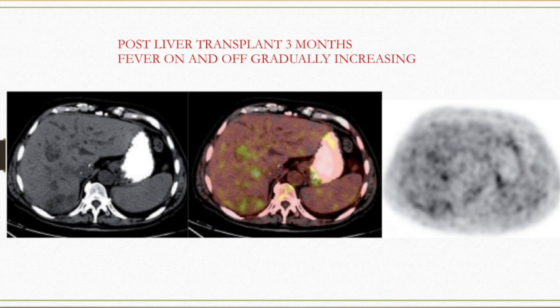This is a very interesting case — post liver transplantation at three months. The liver shows subtle irregular hypodensities with fever on and off, consistent with multiple focal areas of abscesses secondary to infection after the liver transplant. PET is equally helpful in these settings for diagnosing the infective focus.